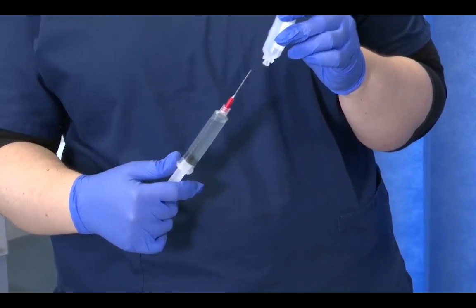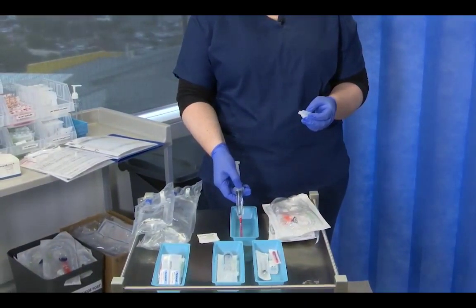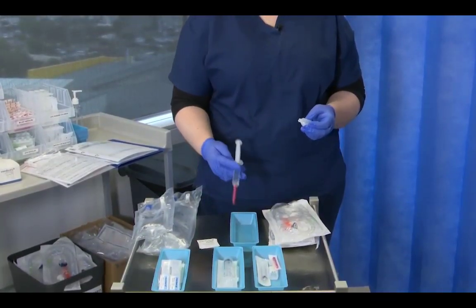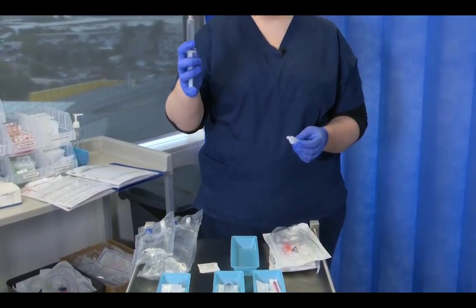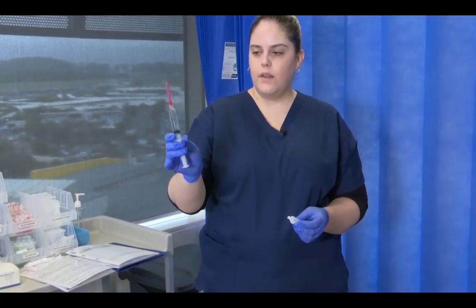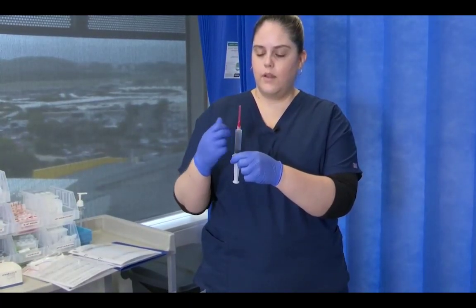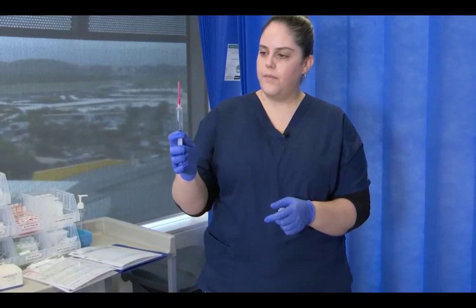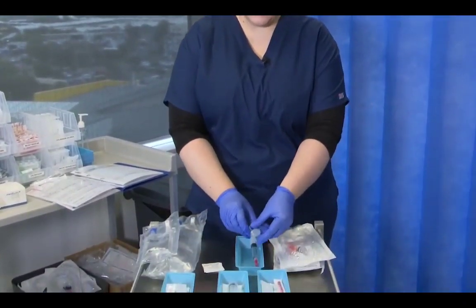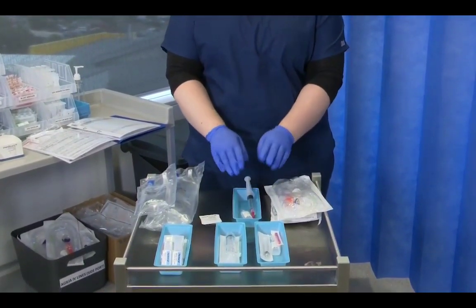So once we've got all 10 ml, we can fish for the cap by grabbing it with the tip of our needle, ensuring we don't touch anything, and we can recap without at any point touching. Once we've recapped, we can remove any air and ensure that we have the required 10 ml for our IV flush. That then goes into the tray with the ampule, because remembering our bedside check requires the ampules to check it with.